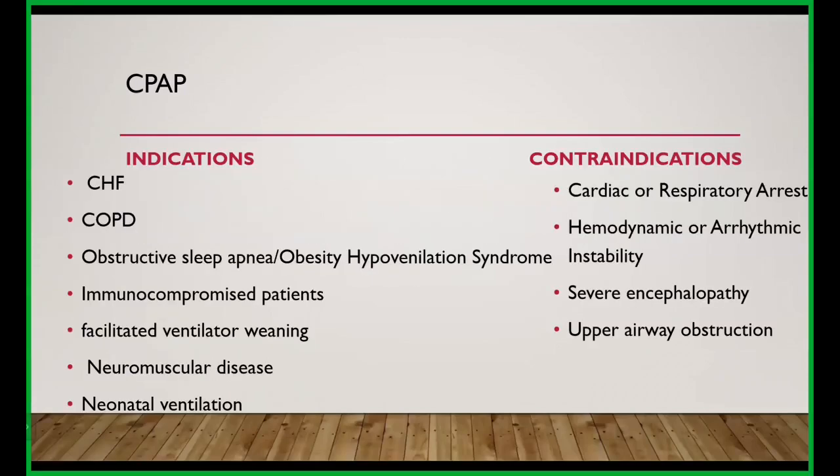Indications: congestive heart failure, COPD, obstructive sleep apnea, or obesity hypoventilation syndrome. In immunocompromised patients, it is an ideal mode, for weaning, in patients with neuromuscular diseases, and in neonatal ventilation. Contraindication: cardiac or respiratory arrest. This mode can never be used. Patients who are arrhythmic or have hemodynamic instability can never have this mode. It is also contraindicated in severe encephalopathy and upper airway obstruction.